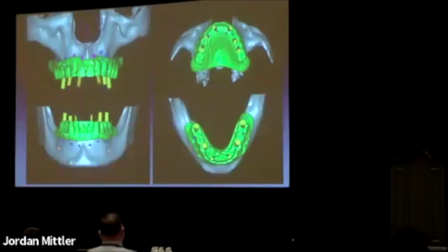And you know, we can also figure out at this time, do we need any angulated abutments? Can we use straight abutments so that I can get to that multi-unit abutment stage as quickly as possible? Because once I get to multi-units, I'm happy. Everything's easy. But you need to make sure you choose the right abutments, choose the right positioning and all that. So we're able to do all that. I'm not going to go into the details of it, but we can do that.